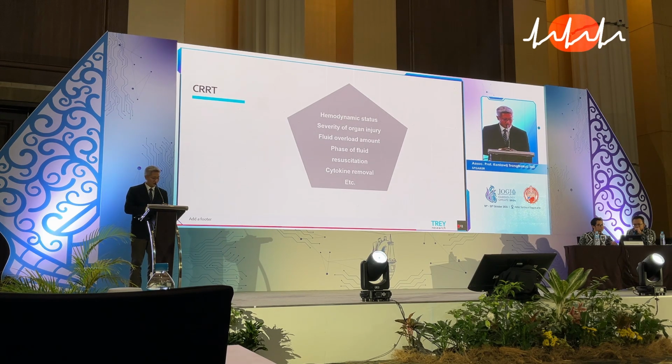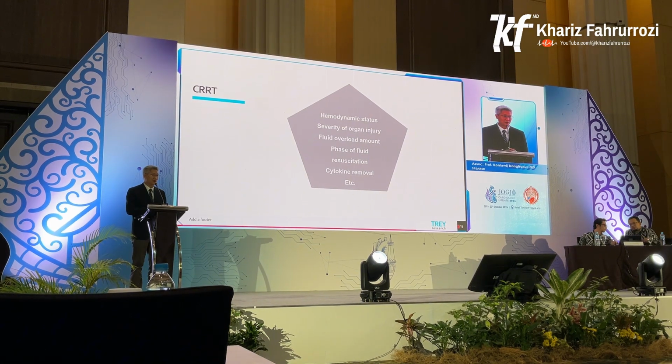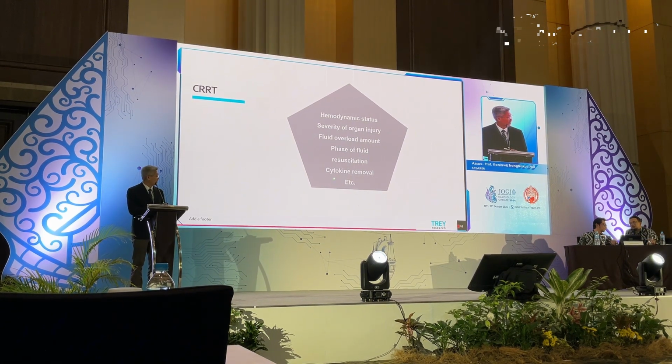When we want to perform CRRT, we should check the patient. Is there a hemodynamic status issue or not? How severe is our patient? How much fluid water is inside the patient? And we should look at, are there any phases? Is there a phase of resuscitation proper enough for removal? Or sometimes, in the case that you think of cytokine storm in the patient, maybe we have to focus on removing cytokines as well.